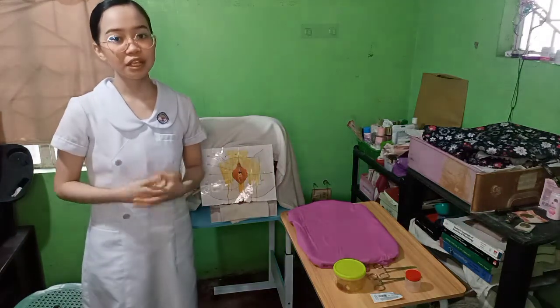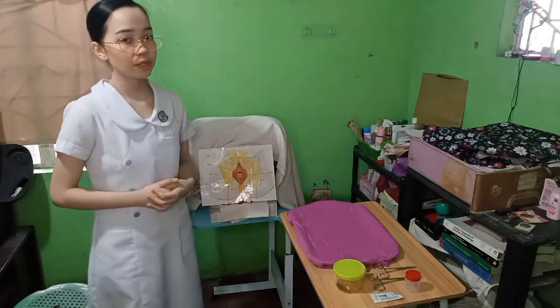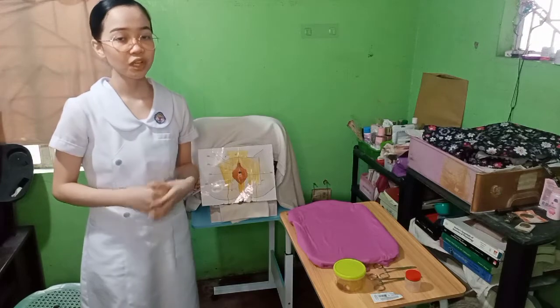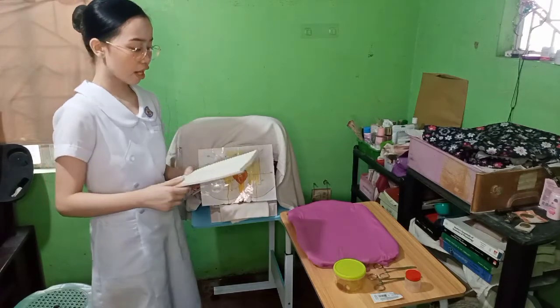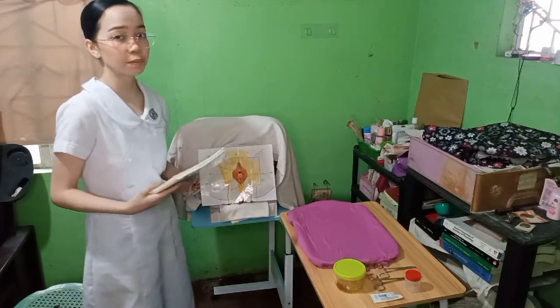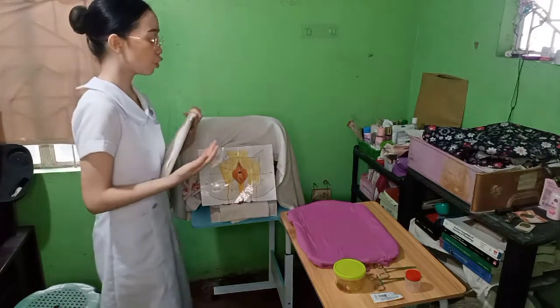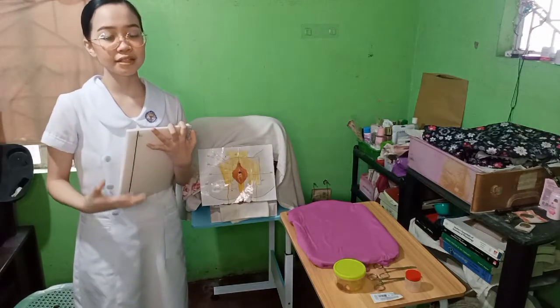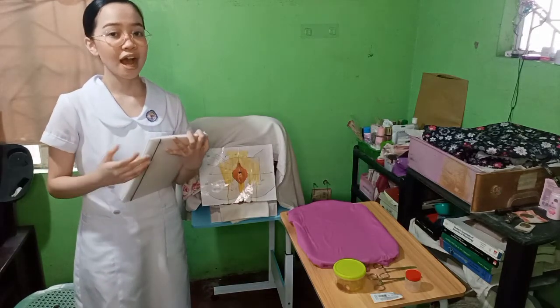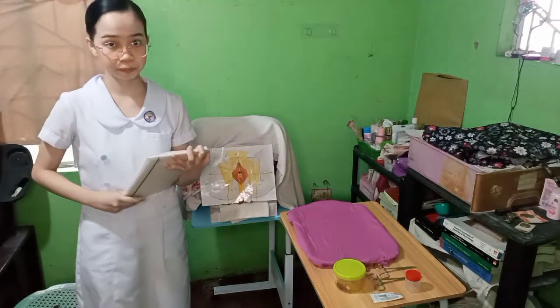And for the documentation, record the procedure and any client's untoward response. Also, record the assessment before and after the procedure for us to compare the condition of the client before the procedure to the findings that we have gained after performing the perineal care and catheterization.